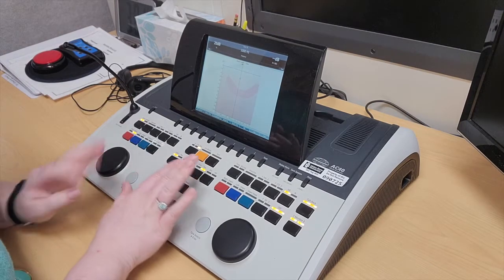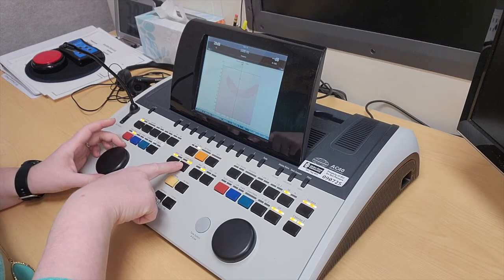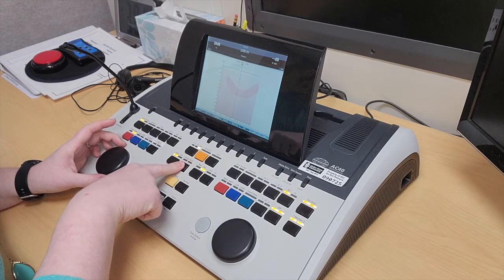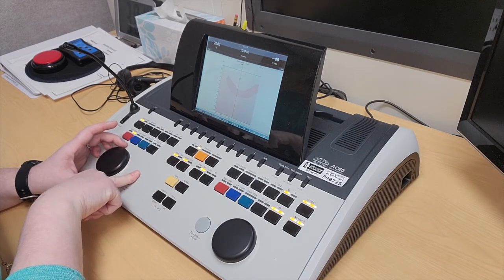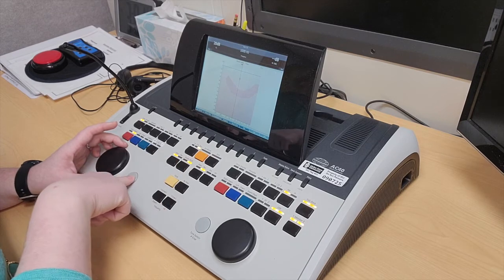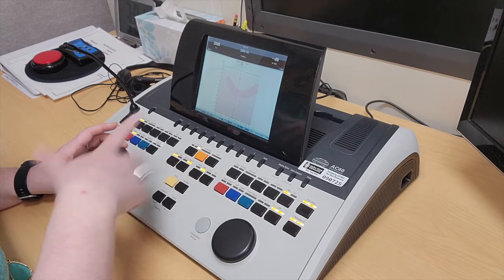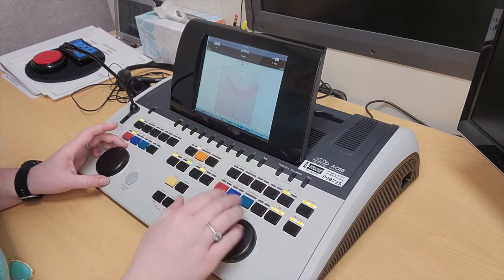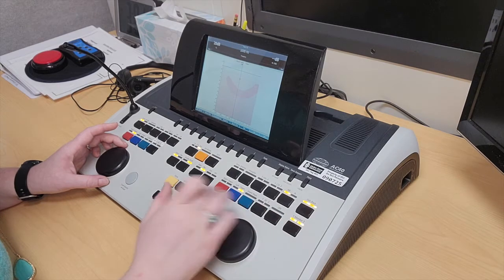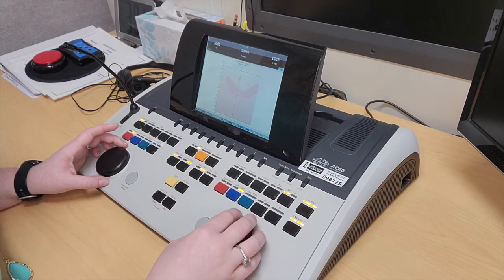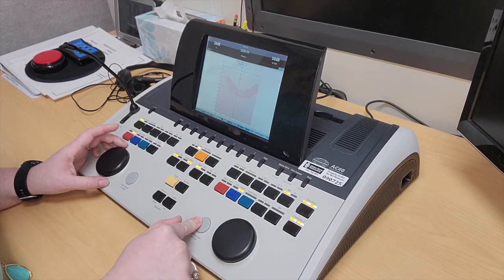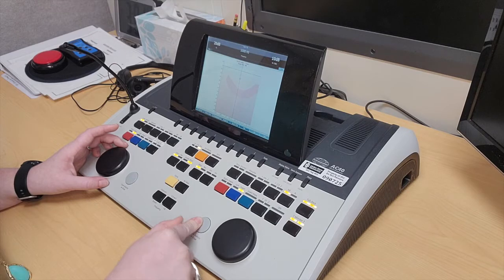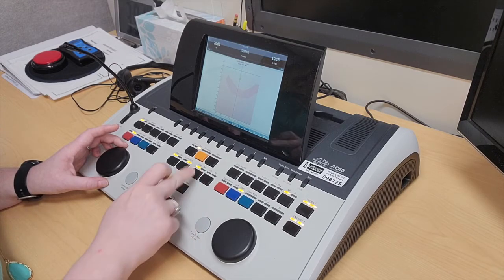Here it also shows if I wanted to do multiple beeps - it's on multiple or single, one long beep, or multiple beeps. This is continuous, so if this is on, the tone is continuous. That's manual, so you press it to turn it on.